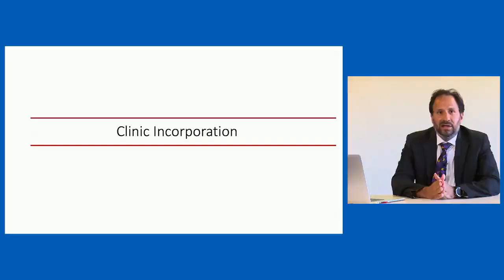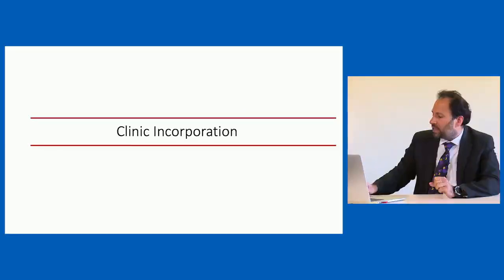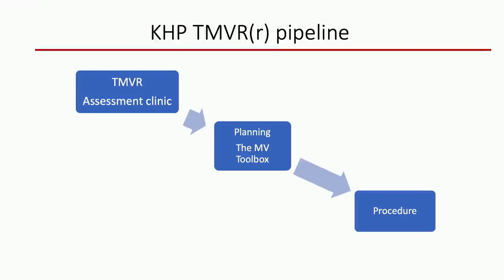So on the previous slides, we've seen how we can use multimodality imaging to help refine patient outcomes. But how do we actually incorporate this into our clinical practice in the real world? So this is an example of our King's Health Partner transcatheter mitral valve replacement or repair pipeline. At our institute, we have a dedicated transcatheter mitral valve assessment clinic, which I run, and all patients who are referred to us have a one-stop clinical assessment.